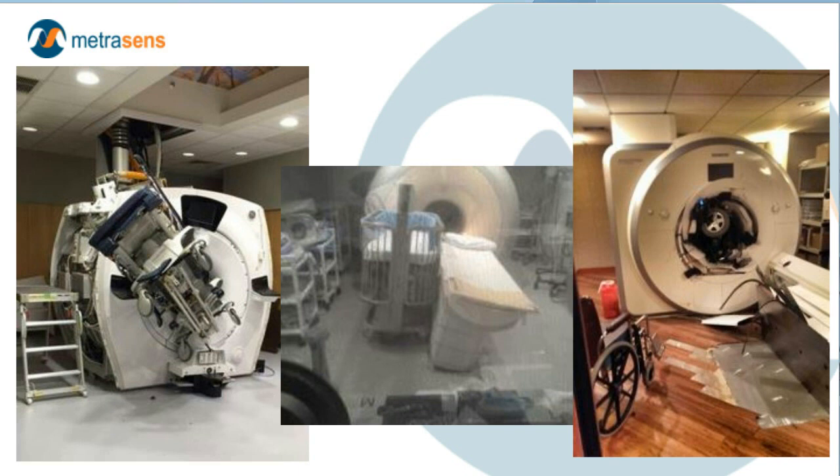So here we're seeing sort of a more exaggerated version of the damage from that previous slide, the crib slide. But here what we're seeing is a motorized wheelchair or an electric mobility scooter.